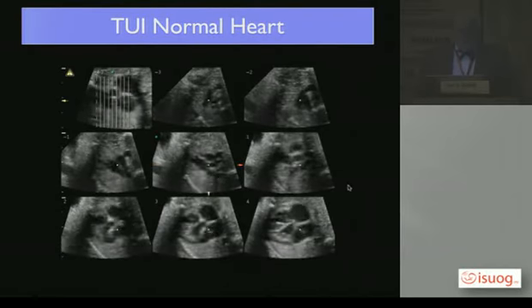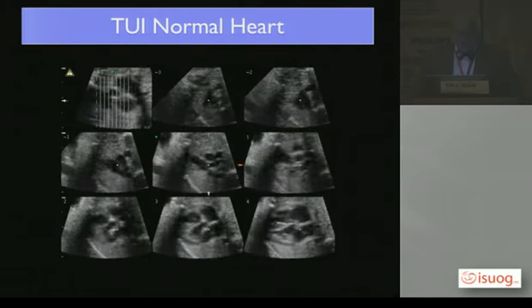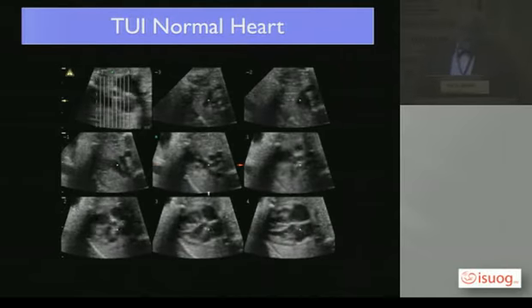Here we can see, for example, the 4-chamber view, part of the 5-chamber view, the 3-vessel view, and the tracheal view, all displayed on the screen as we're looking at this image. So we simply acquire the volume, push 2 buttons, and there we have the images, all displayed one next to the other. This is the easiest way, I think, to see this type of anatomy.